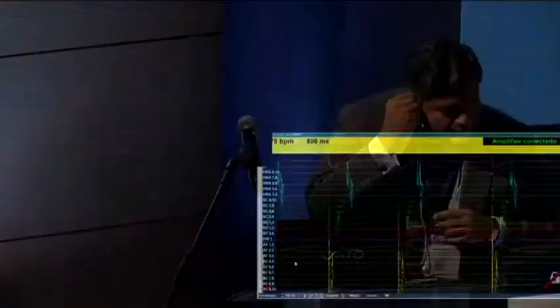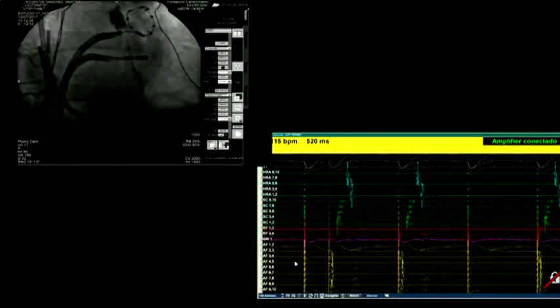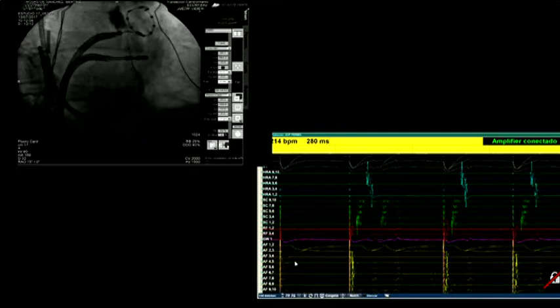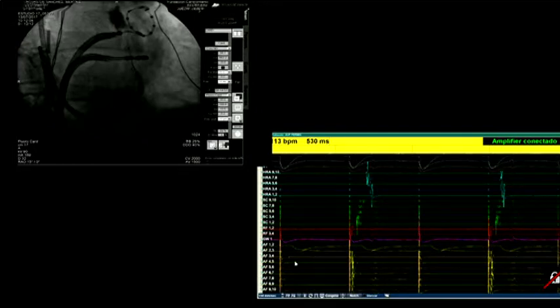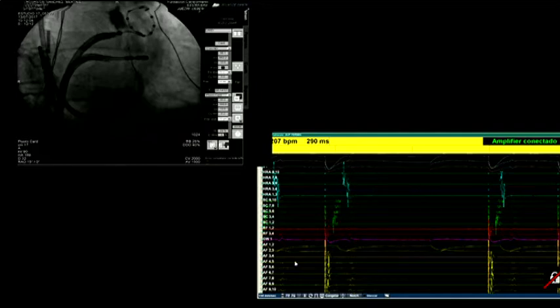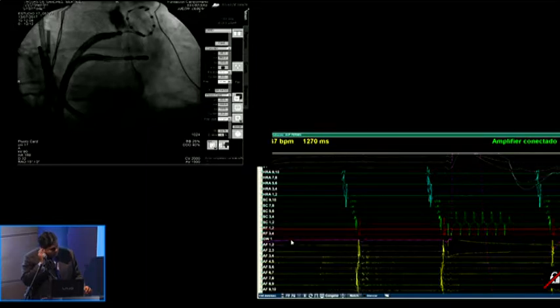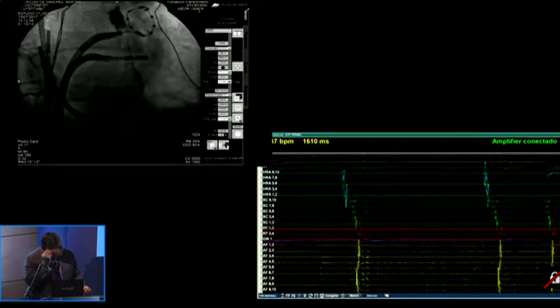We didn't see any system to protect the esophagus in the cryoablation. Could you repeat that? There was no translation yet. We didn't see any system to protect the esophagus in the cryoablation. What do you, some comments about that?